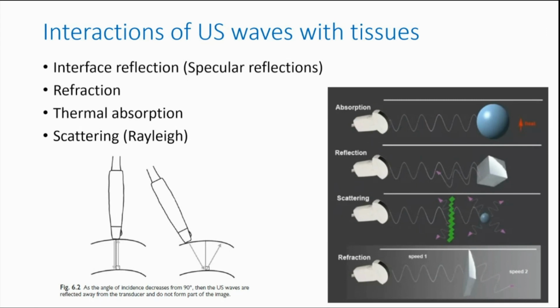So, for example, with blocks like the popliteal sciatic, it is very important that you gauge the depth of the sciatic nerve, and then insert your needle perpendicular to the probe. So that when the needle goes into the tissue space, it is seen as a very bright white line because it's an ideal depth and direction. In that kind of scenario, there is no excuse. You must see the needle. If you cannot see the needle, it is not an acceptable needling technique.